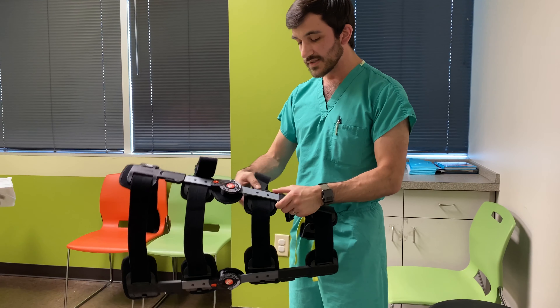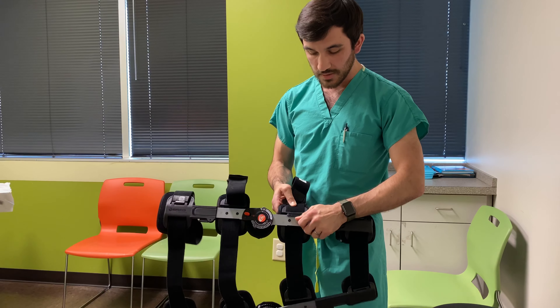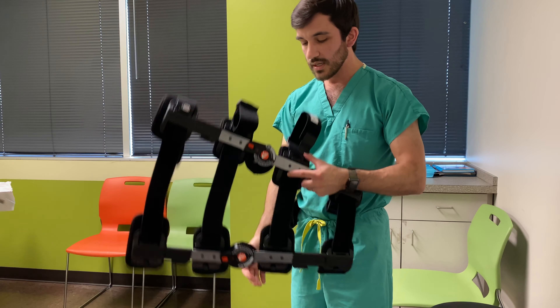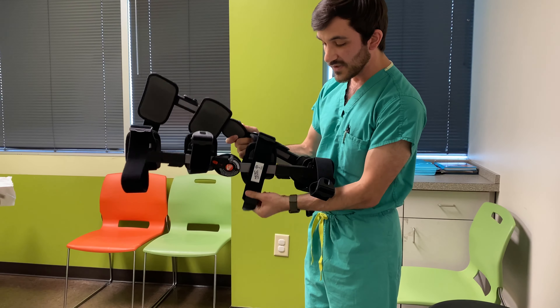When you're tightening the brace, you have a couple of different points to do so. One is this friction clip, which helps you take slack out of the brace or loosen it up if it gets too tight. Second, you clip the brace in and pull the slack out of the front.